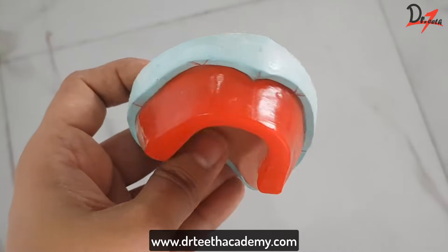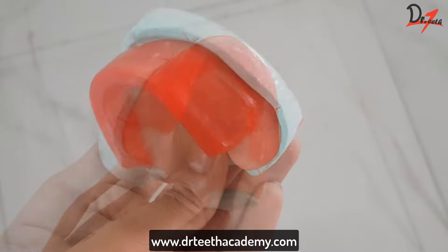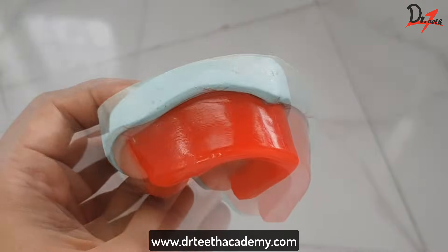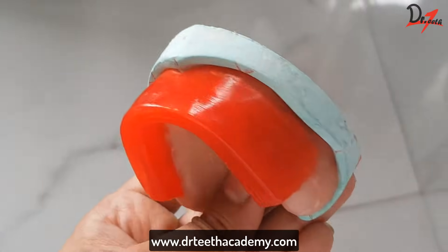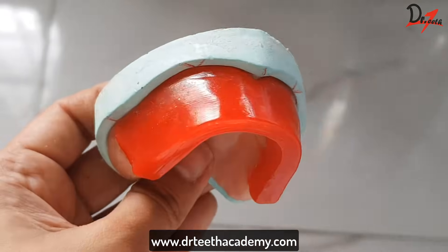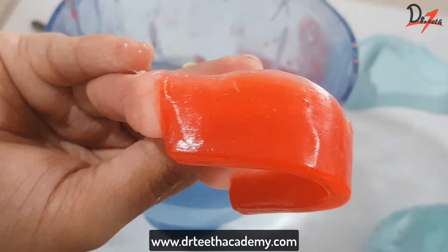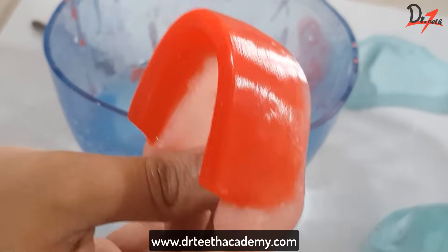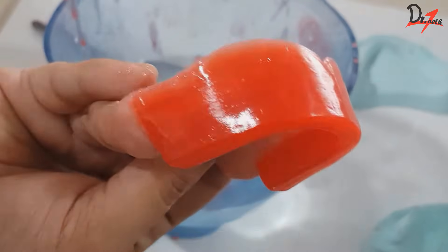Dentistry is an art, and mastering the art not only requires hard work but also knowing the technicalities of it. In this video we will be learning how to make the maxillary rim — how to get the proper shape, proper dimension, and of course that beautiful shine. If you want to know how to get the perfect rim every time you make it, keep on watching.